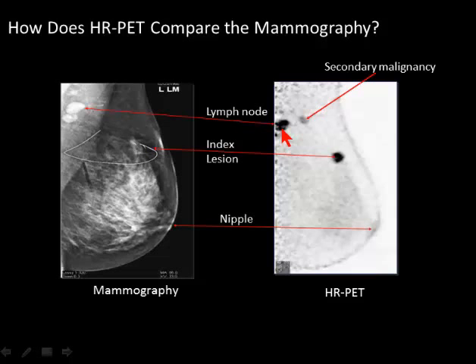One of the things that we've known from whole body PET-CT imaging for the last decade is that as soon as the cancer leaves the tissue of origin and can survive in the lymph node, it has further upregulated the GLUT1 transporter, and it typically takes up more FDG than the primary cancer. So it's easier to find the metastatic lymph nodes than sometimes the primary cancer. And that goes across the board for all cancers. Breast cancer is no different.